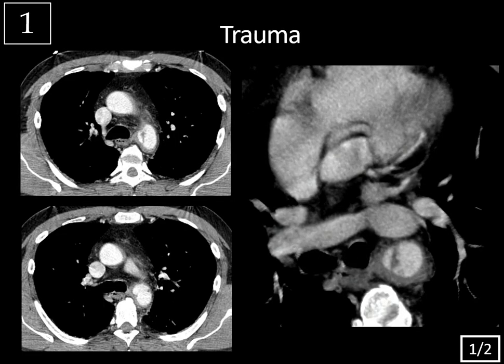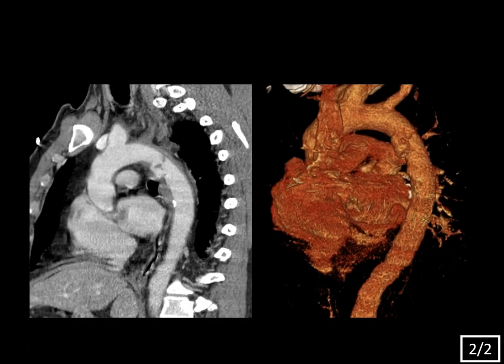Case 1, history of trauma, CT Angiogram of the Chest. Slide 2 of 2, sagittal and volume rendered reformats.